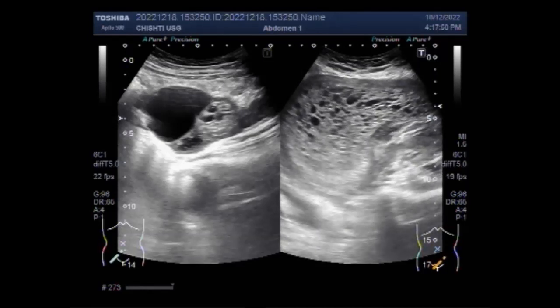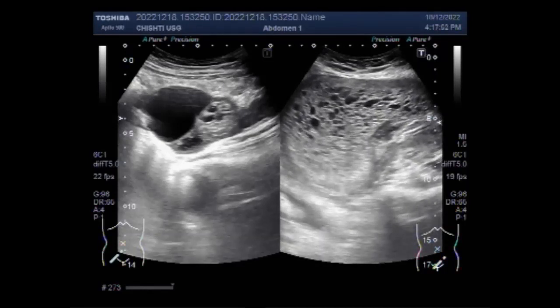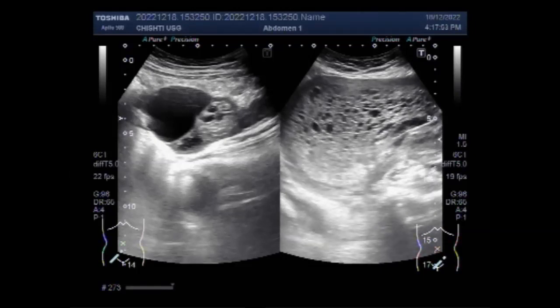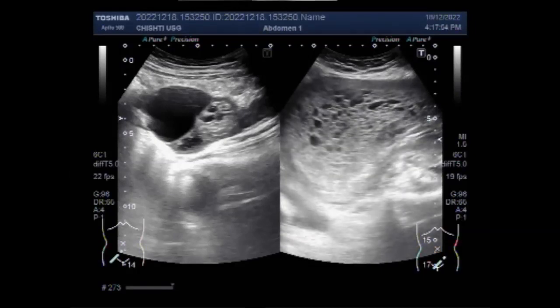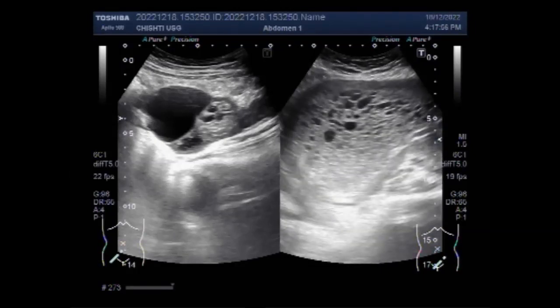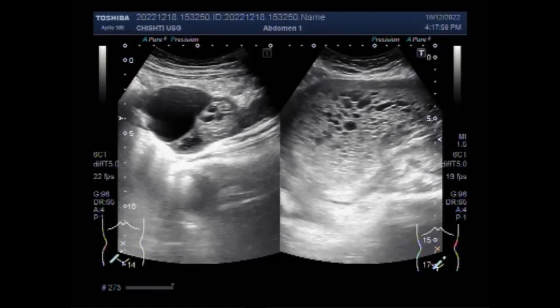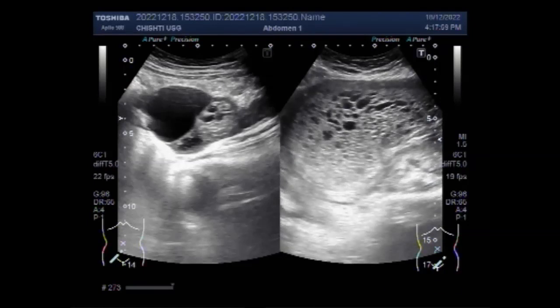The ovaries are often seen to contain large cysts. As you can see in this case, a large right ovarian cyst is visible.